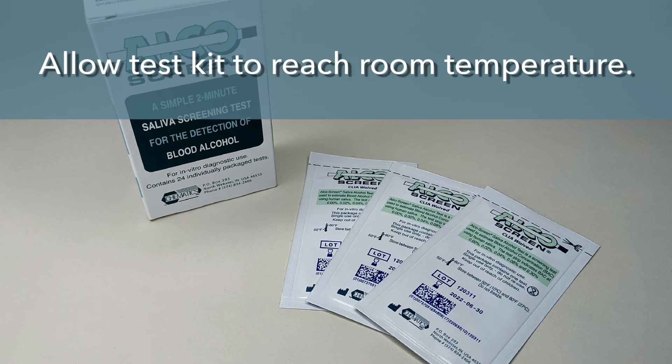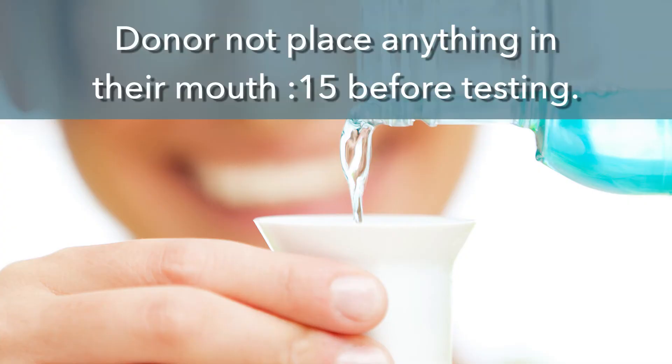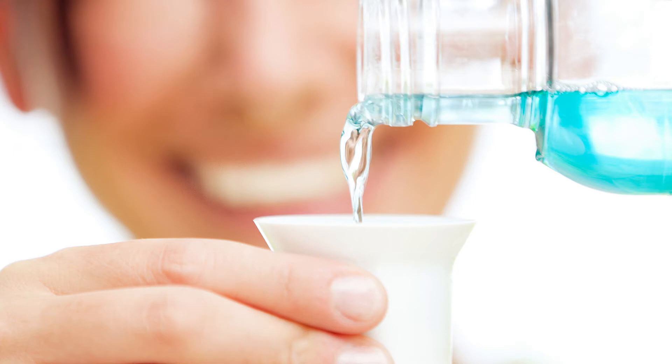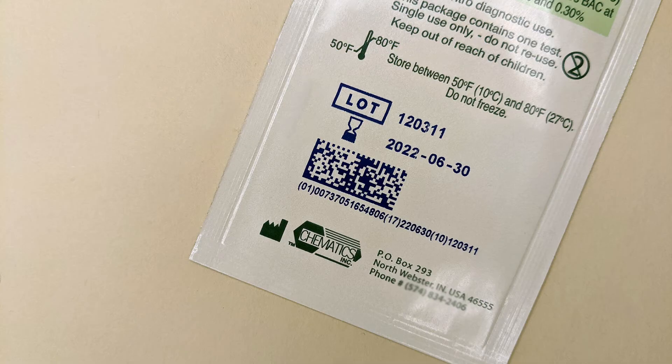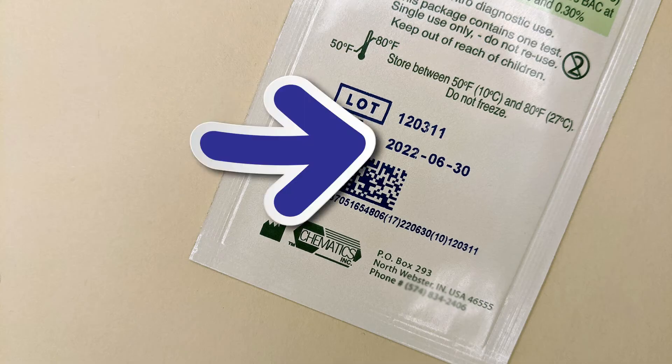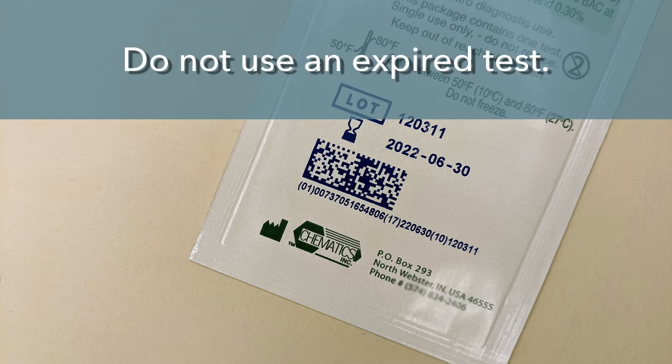Before you begin, allow the test kit to reach room temperature. It is important the donor not have placed anything in their mouth for 15 minutes before testing. This removes any objection that a positive test result was from residual mouth alcohol. Allow the donor to select an unopened package. It is best practice to show the donor the expiration date on the front of the package. Do not use an expired test.